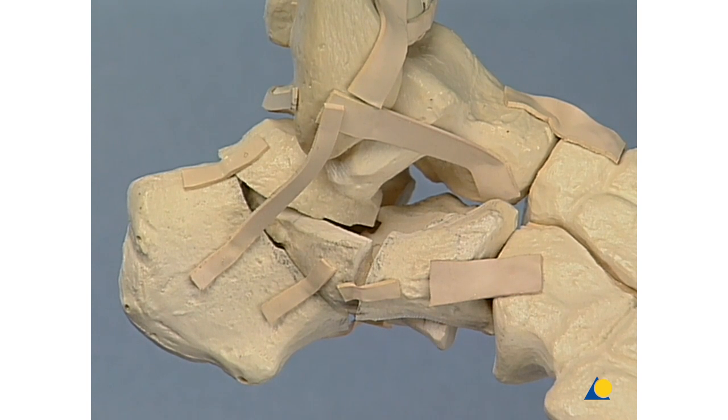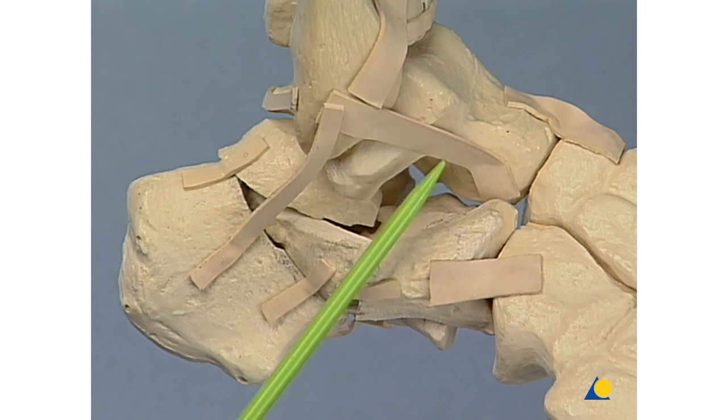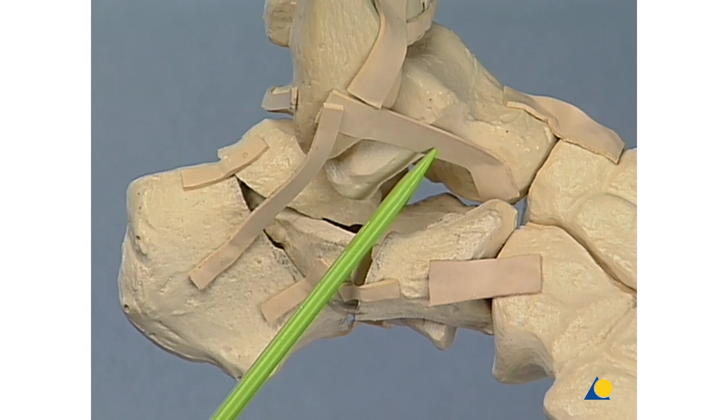Two important ligament structures should be mentioned: here the fibulocalcaneal ligament, and here the anterior fibulotalar ligament.